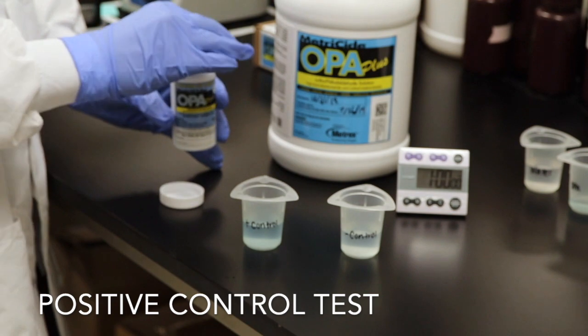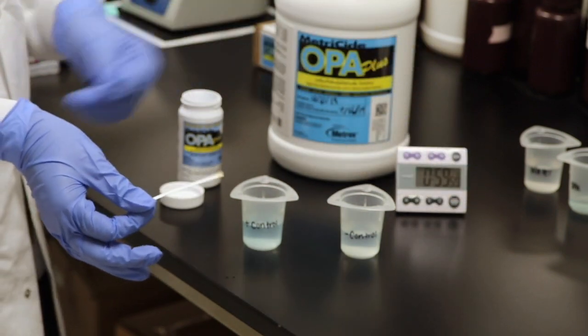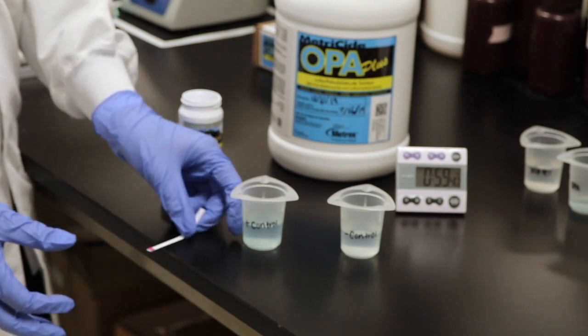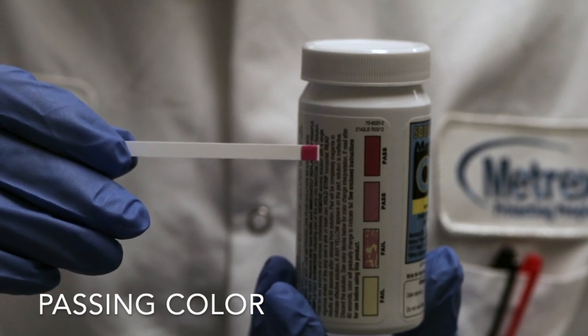Perform the positive control test by taking one test strip and dipping it in the solution for two seconds. After dipping, vigorously shake the test strip once and hold horizontal for one minute. After one minute has elapsed, read the results against the Metricide OPA Plus test strip bottle. The strip should turn a magenta color.